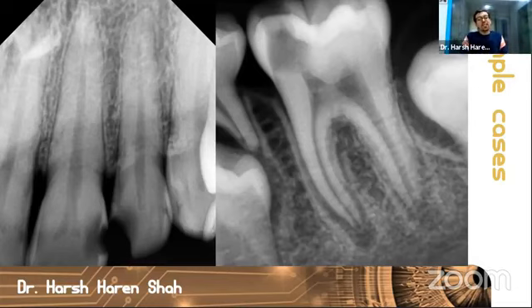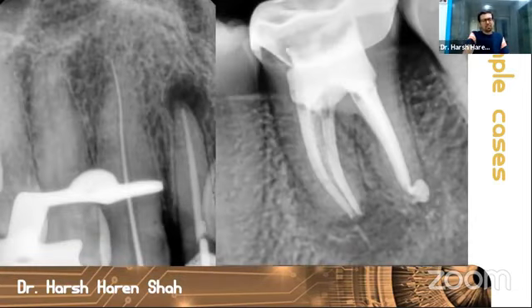The second factor that we consider is the curvature of the canals. So if you can see, even though in this molar there is a slight curvature, this curvature is very gradual. We don't expect this curvature to create any issues for us, especially because it is gradual and the canals are wide. In such simple cases, establishment of glide path and consequent instrumentation and obturation become extremely simple.